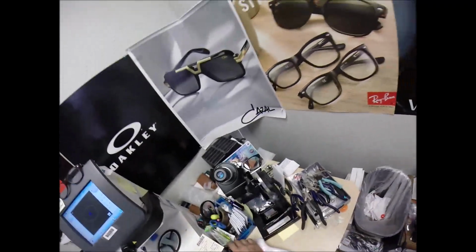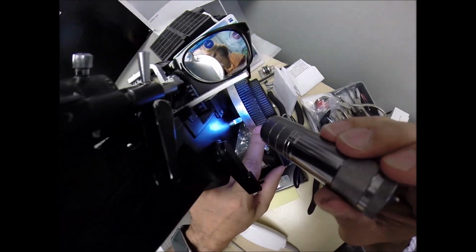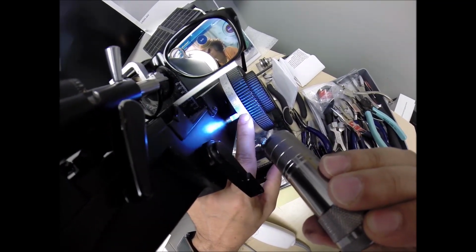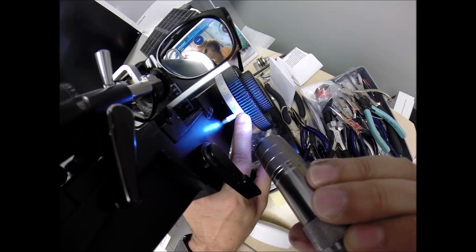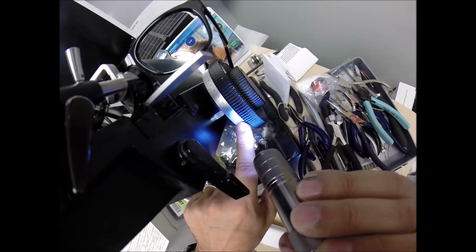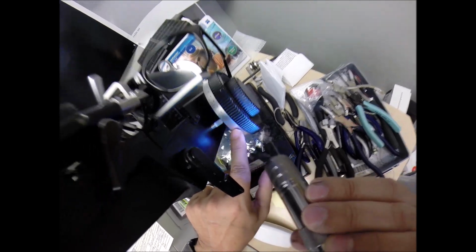Read the power, and I am getting +1. Exactly halfway between 0 and 2. Now if you notice, the 1 is a black number. There's a plus symbol for far-sighted people, and for myopes, nearsighted people, there's a minus in the red.